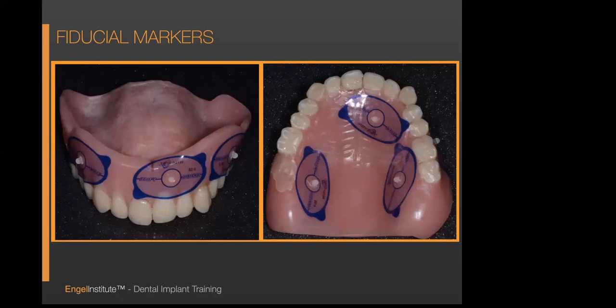So what I'm going to show you is something that has been used in a lot of different entities of life, okay? And it's called motion capturing. And the way that we're going to do this is we are going to have 2 points that aren't connected, and we're going to connect them. And I'm going to show you an example. So what we're going to do is we are going to use what's called a glass bead.